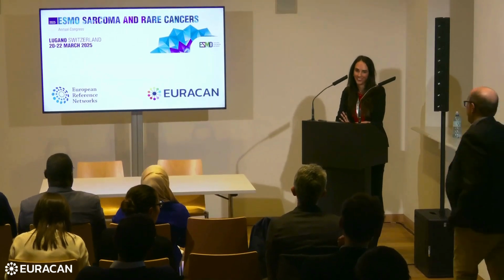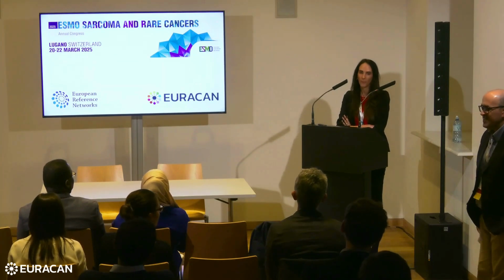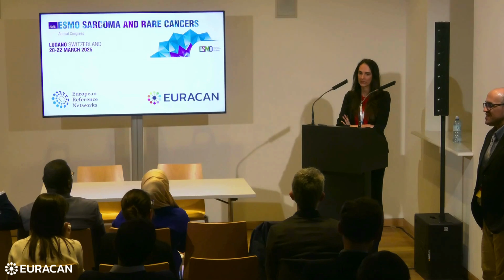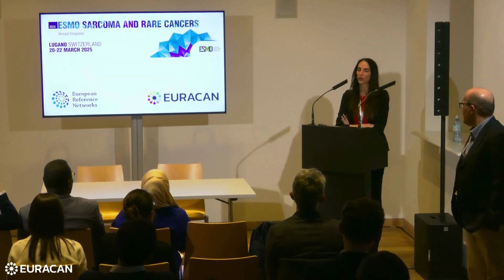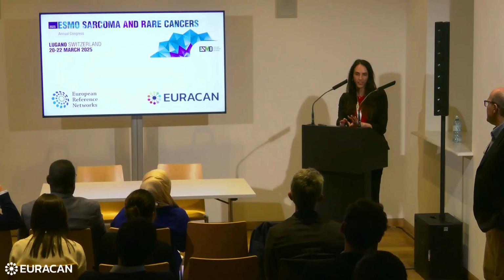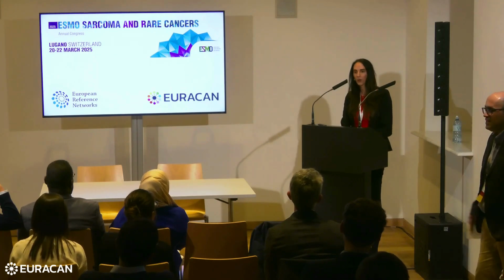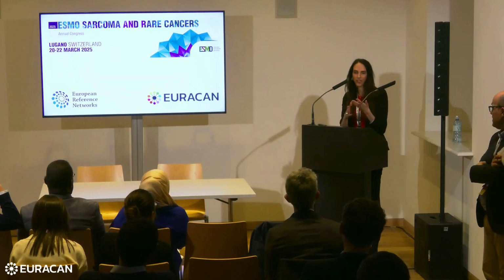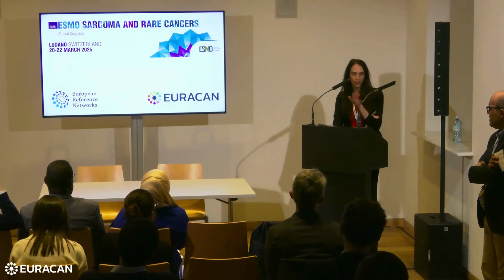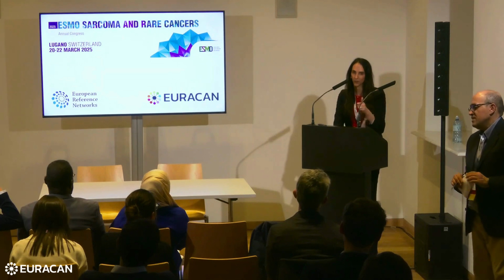The first one is, what is the evolution of the mismatch sign during time? For example, can we use the mismatch sign to follow up patients even during anti-IDH treatment? I would not rely 100% on this sign. It's good for therapy-naive grade 2 astrocytoma, but also in grade 3 or in grade 4 astrocytoma, I don't think it's reliable anymore. And also, I have no data when it comes to IDH inhibitor therapy. I don't know it yet, but it's just one sign of many.